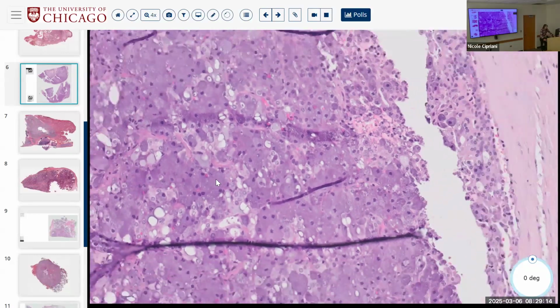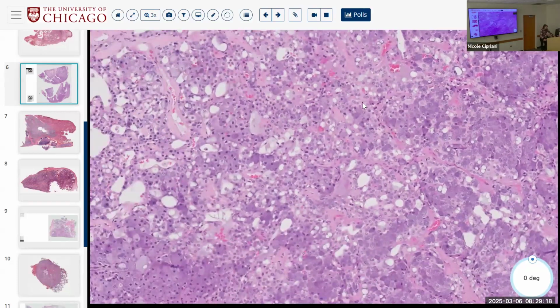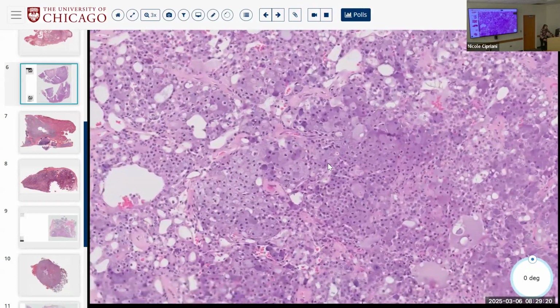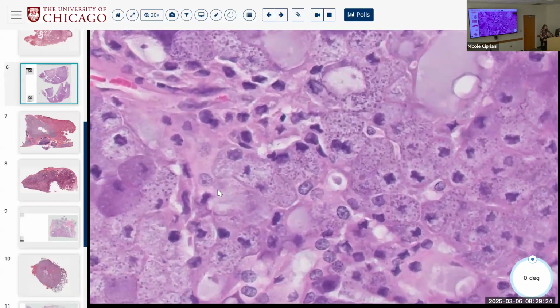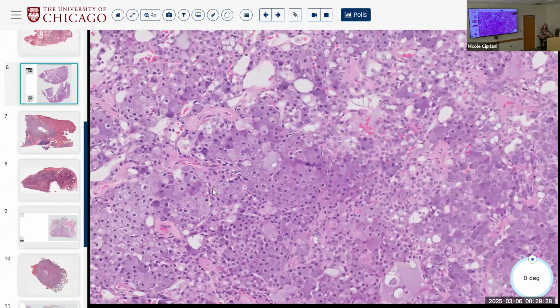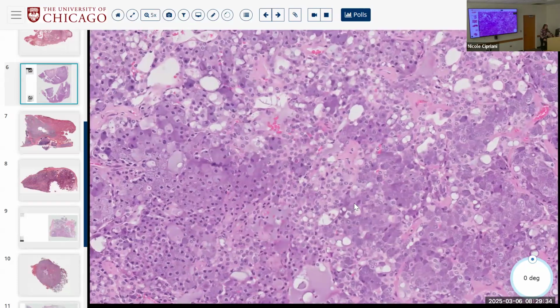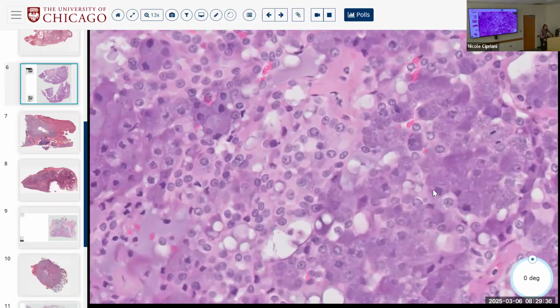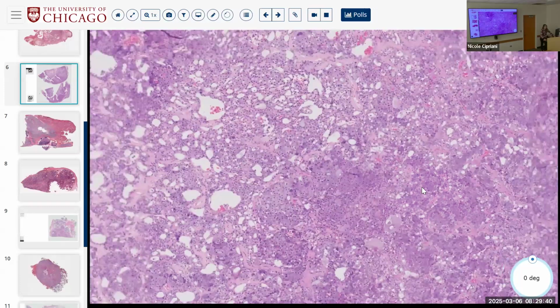Or you can do your PAS diastase, if you wanted to, because the zymogen granules will not be digested out. So yeah, those little guys. The other stain that we talk about with the acinic cell is DOG1, having apical or kind of luminal expression. I don't have a scan slide of that, I'm sorry, but we don't use it very often because usually the morphology is obvious.